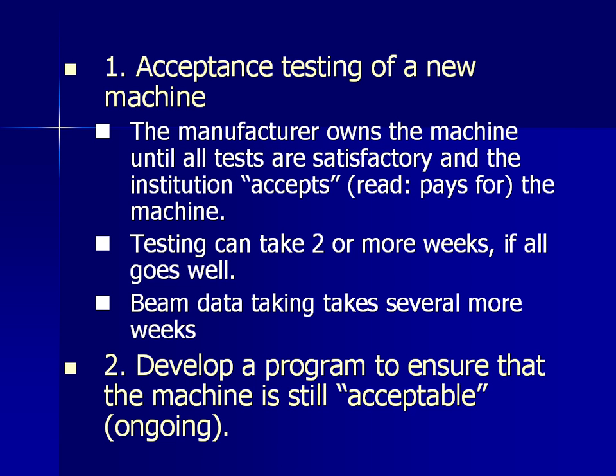The other thing is that in some cases, the vendor will allow you to do some of the data acquisition at the factory before the machine has even been delivered. So you can go in there, acquire the data, and then once the machine is installed and accepted, you can do some spot testing.